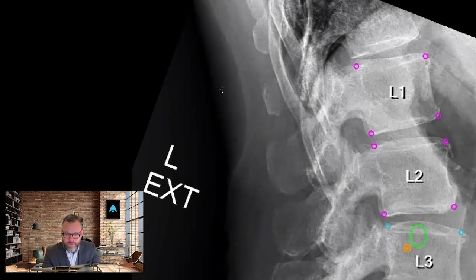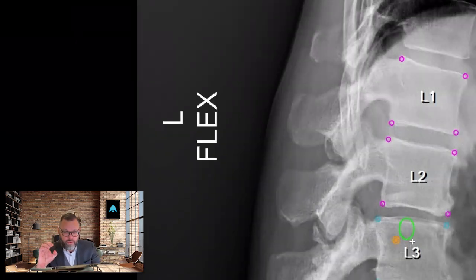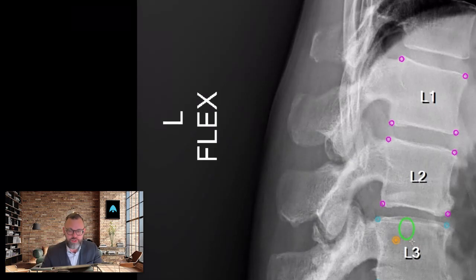I move down to each level and I start to look. Now, my eye actually starts to see this doesn't look like a normal motion pattern. And lo and behold, SpineCAMP alerts me that the center of rotation is outside of normative data. That green circle is telling me that if we put a whole bunch of people in a room, which SpineCAMP did, and we measured all of them, and we looked at that motion pattern, this is where the orange dot should be. But we see her orange dot is outside that. So that's just a data point that helps me to think about what's happening with her.